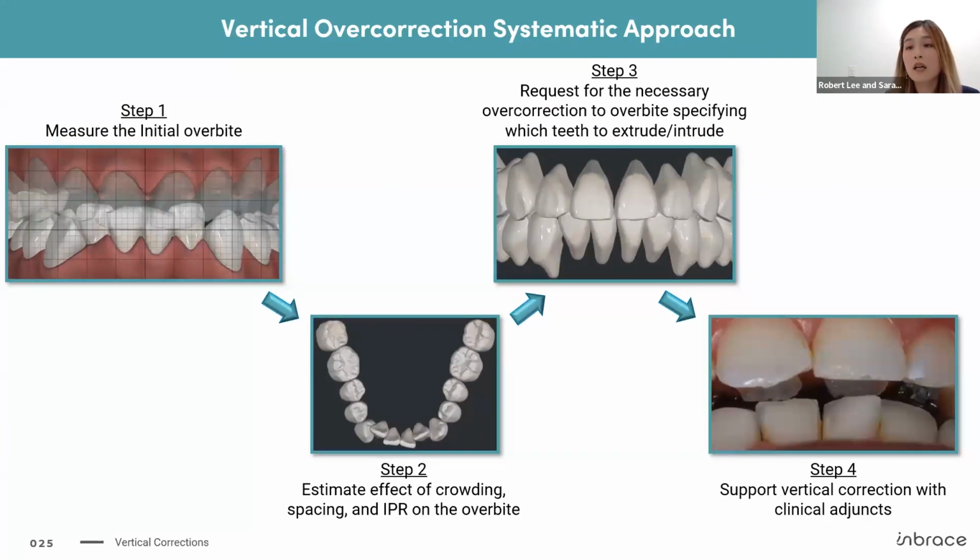Finally, after you have your smile design beautifully planned out, you want to make sure you support your force systems with your clinical adjuncts. So with your bite turbos, with your elastics, as needed.